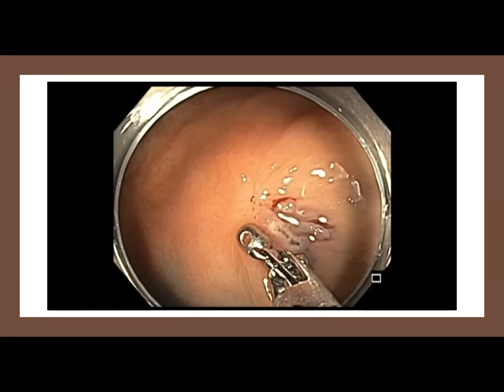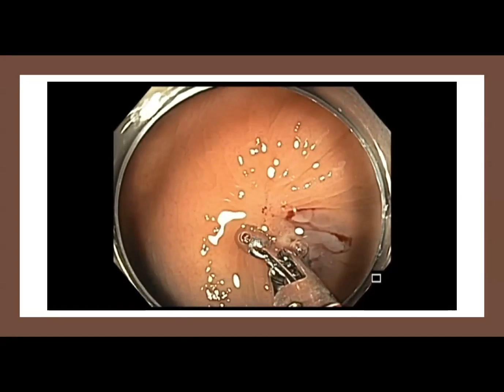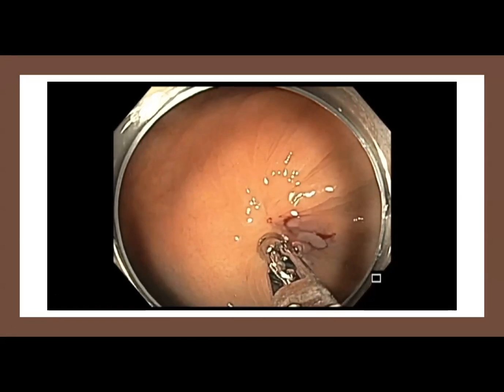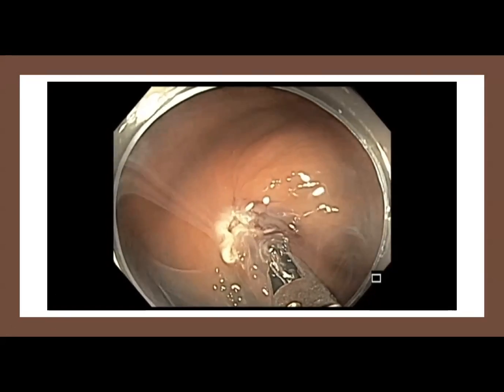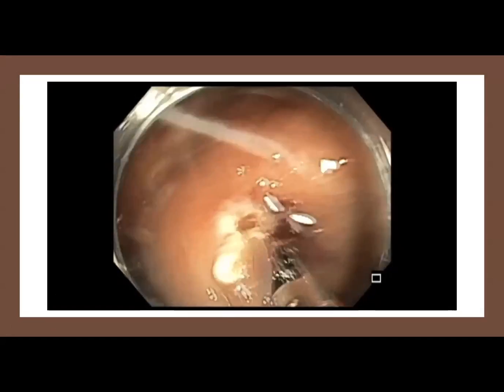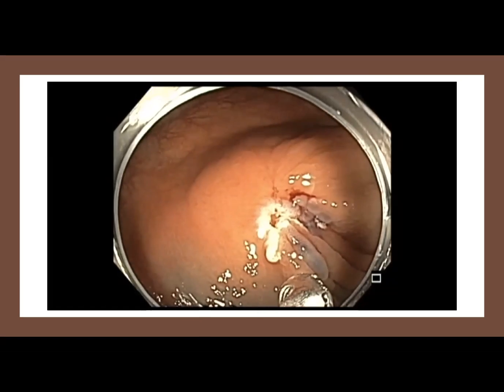So there's a little bit on the left side, but on the right side of the thing. And we use Endocut I, effect 1, and duration 3. And the interval is set at 3, and it doesn't matter.